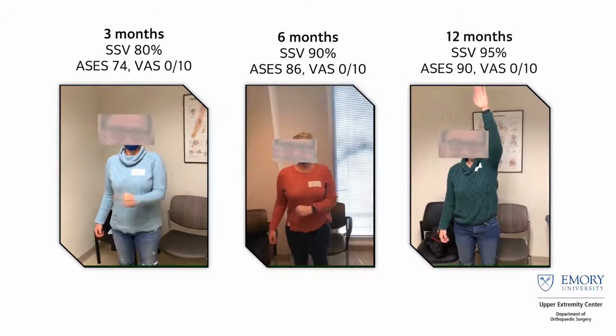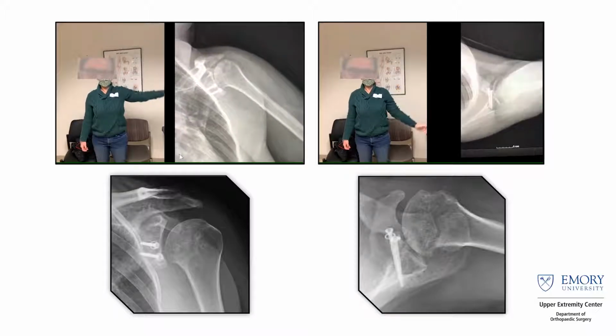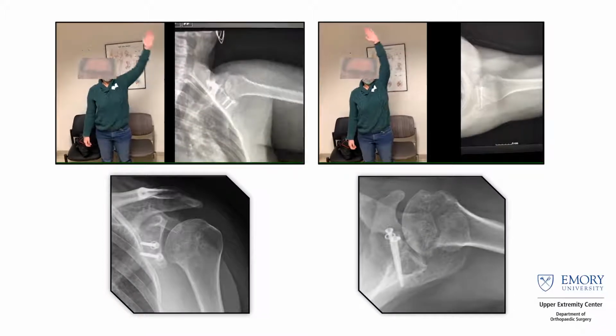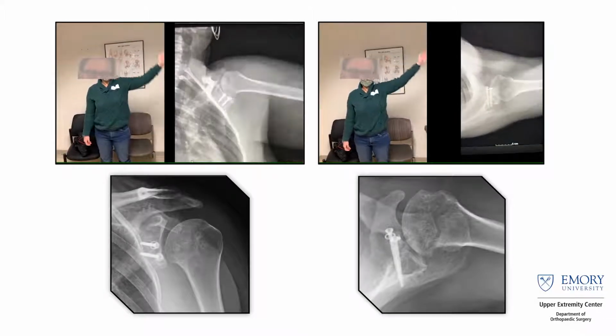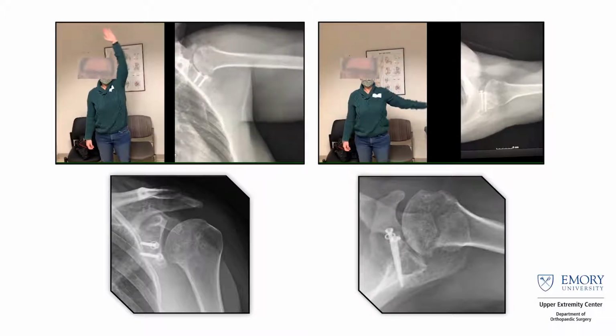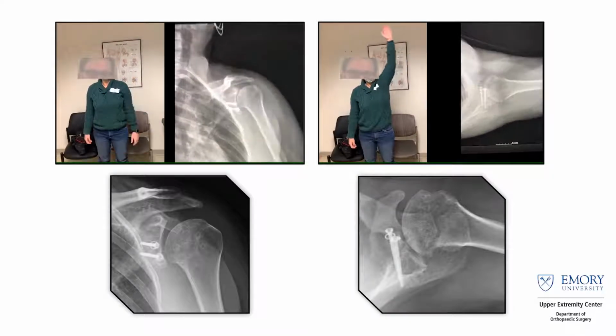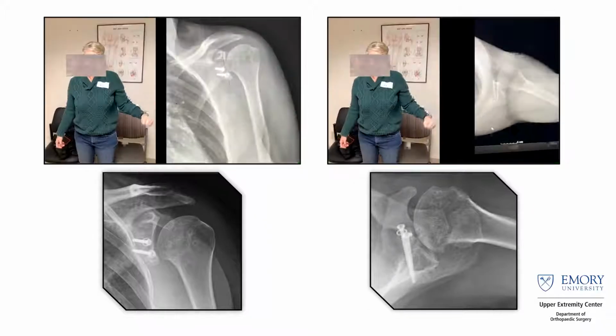Basically very little limitations. The cool thing about the DDR is you can actually see what's going on, how she actually stayed inside the joint, and she's actually centered over that distal tibia allograft you can see in the upper right. On the X-ray view, it also kind of shows how, legitimately, what we did is we didn't necessarily recenter that well. What we did is we created a bigger surface area for her to now function on a bigger platform.